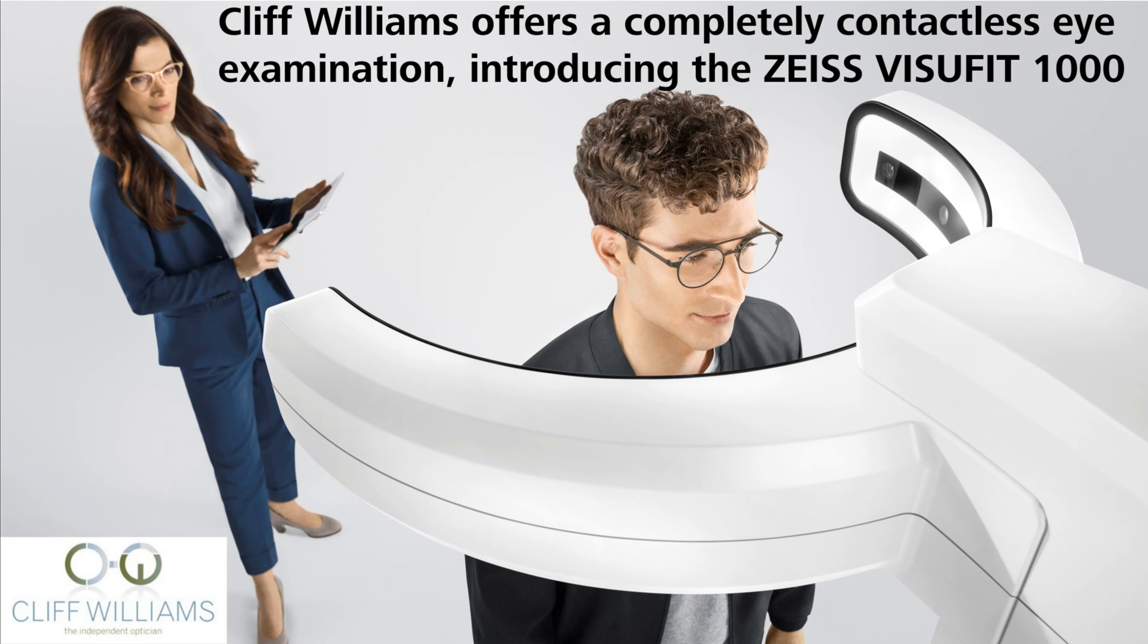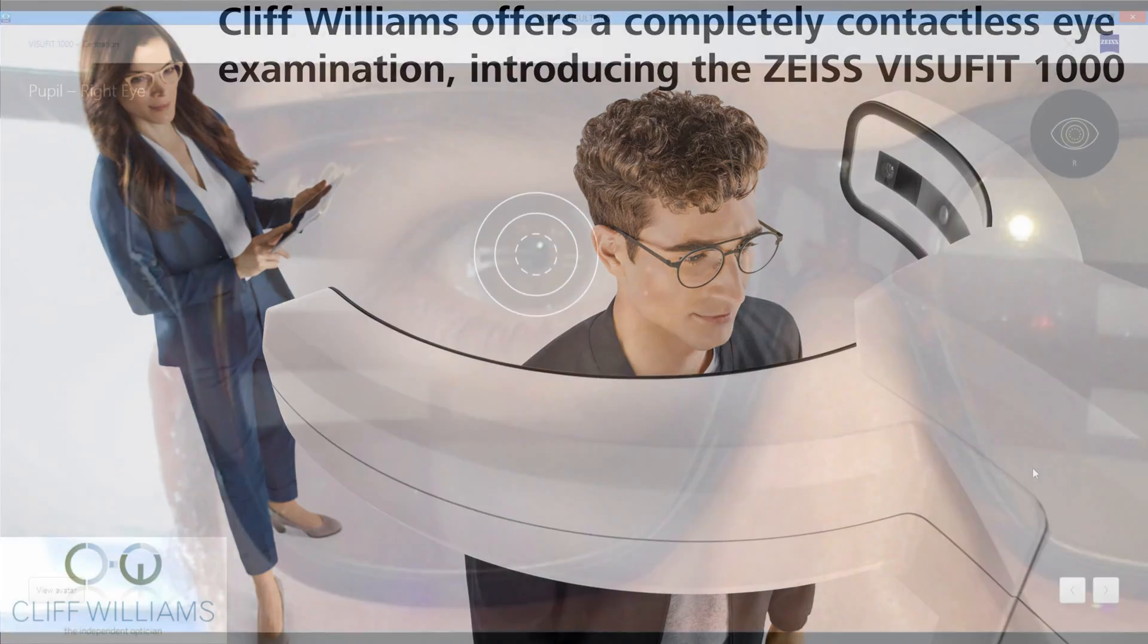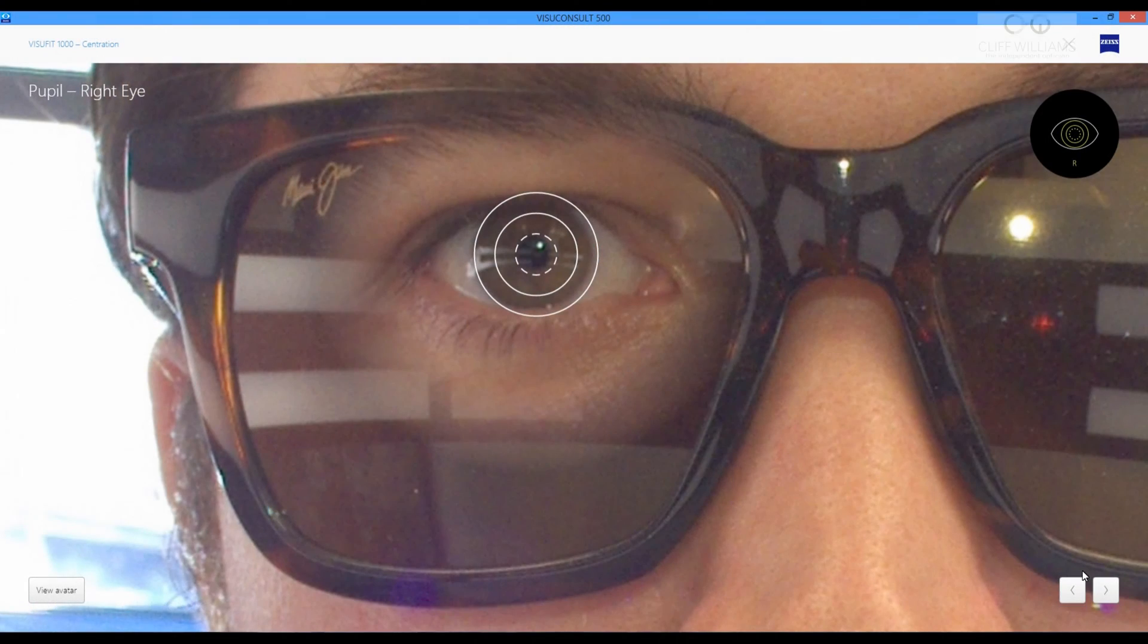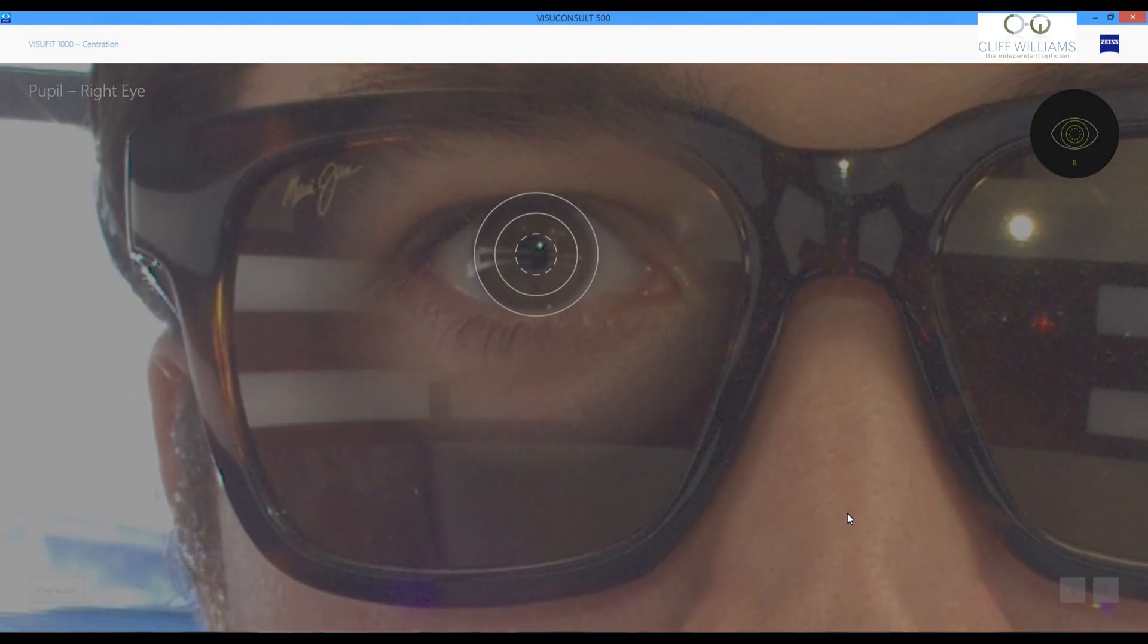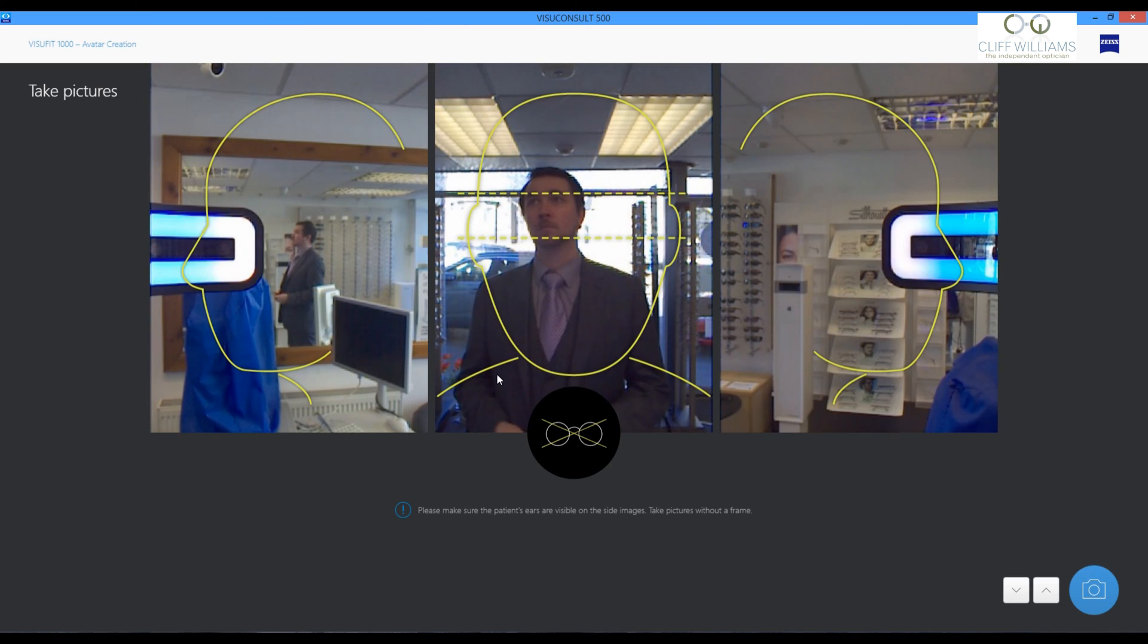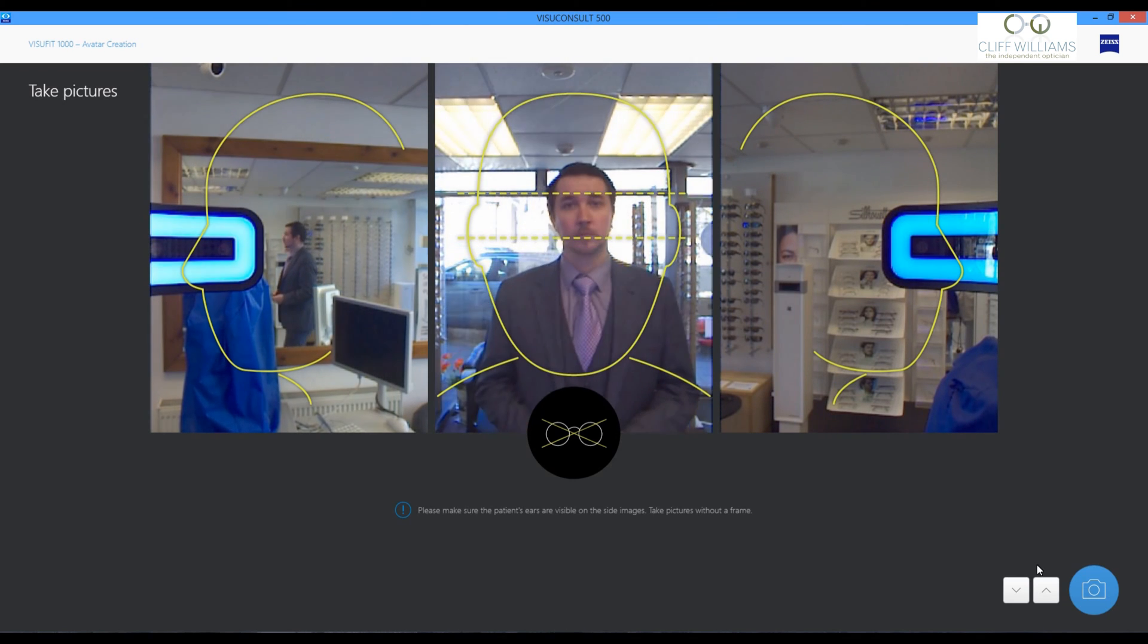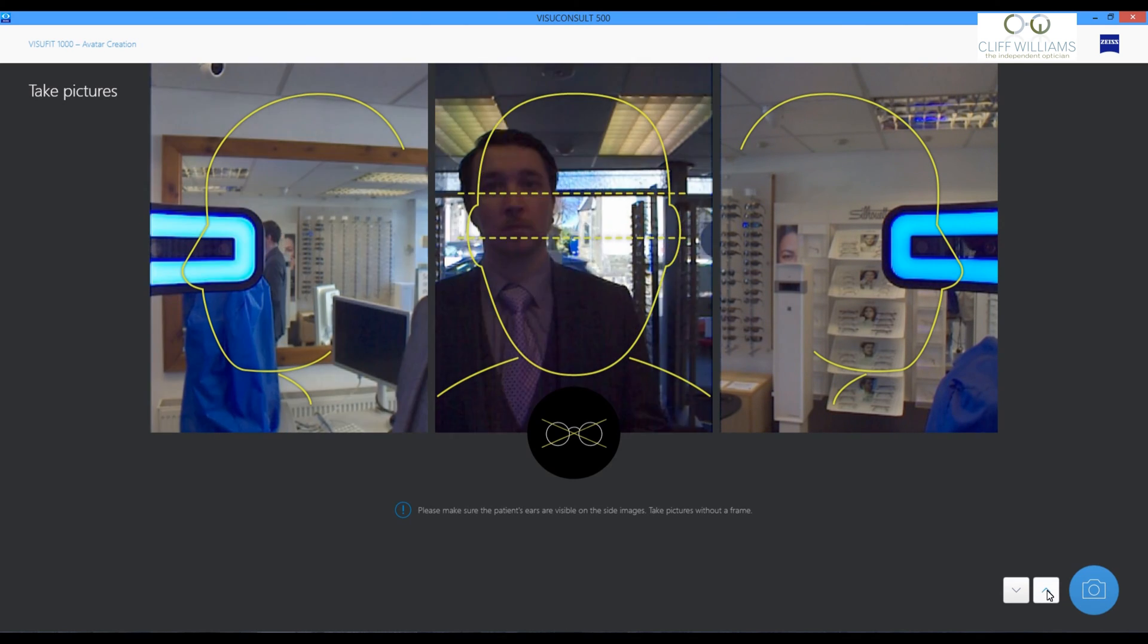The latest innovation for the Zeiss VisioFit 1000 allows us to measure sunglasses. It has been quite tricky in the past because we're trying to look through a dark lens to find the position of the pupil for precision.